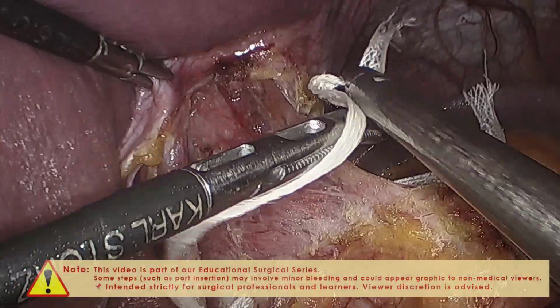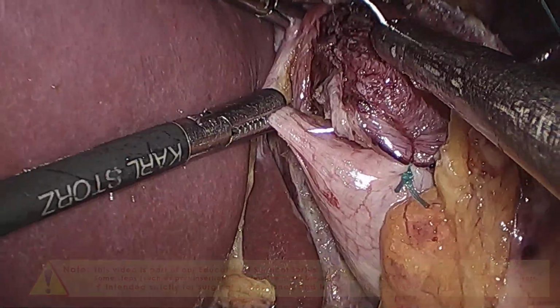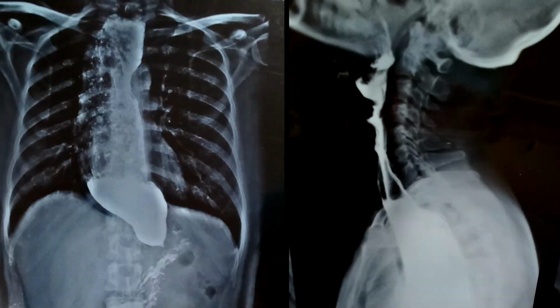Hello everyone, I am going to show an interesting case. This is a case of Achalasia cardia for which we are doing laparoscopic LS cardiomyotomy. You can appreciate the barium swallow study image.